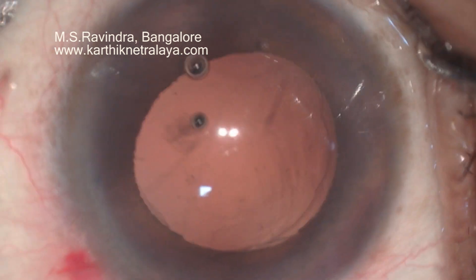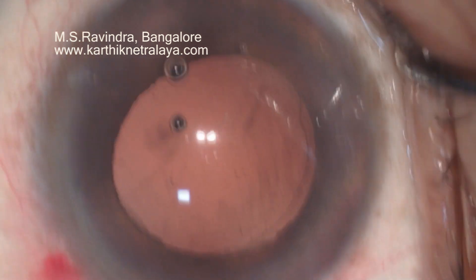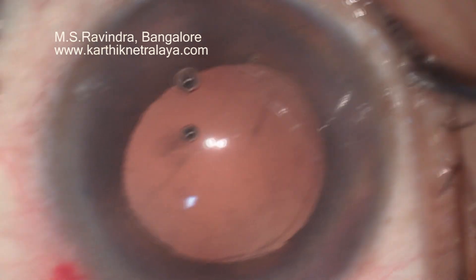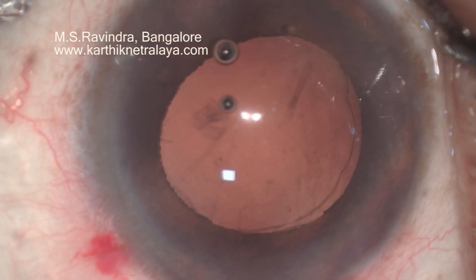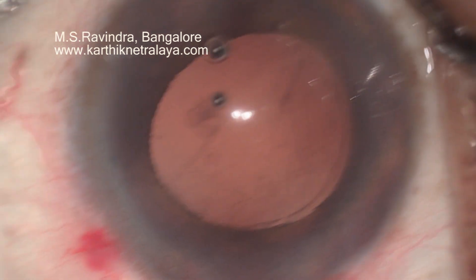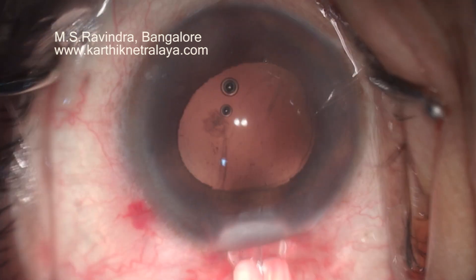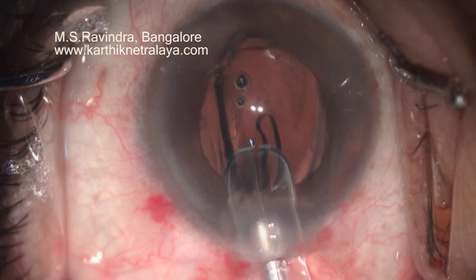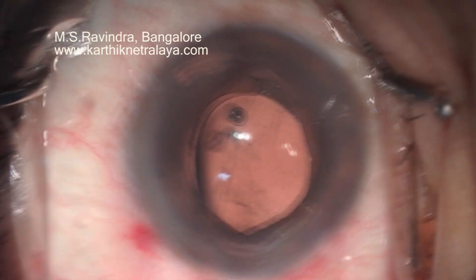I am assessing the situation — what to do at this stage. I can fix a retropupillary retroiris lens, or I can go into the vitreous cavity and put a scleral fixation lens. But I decided to put the lens designated for this patient, the hydrophobic acrylic lens, in the sulcus.